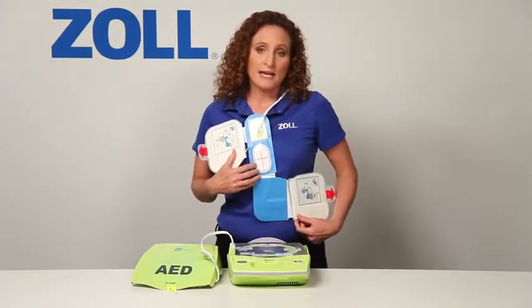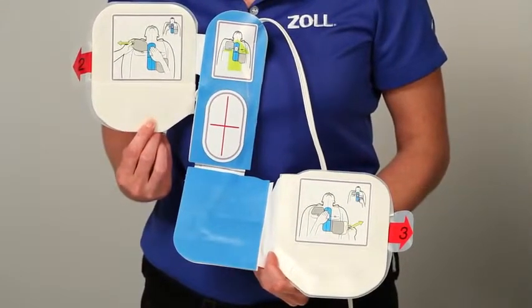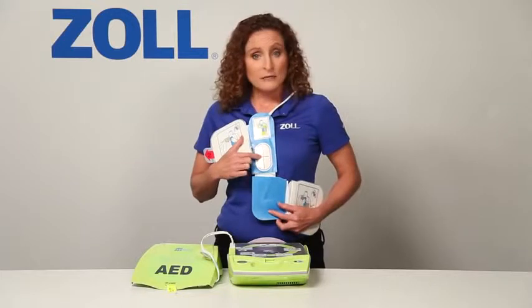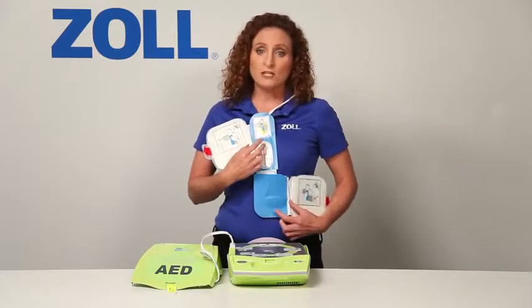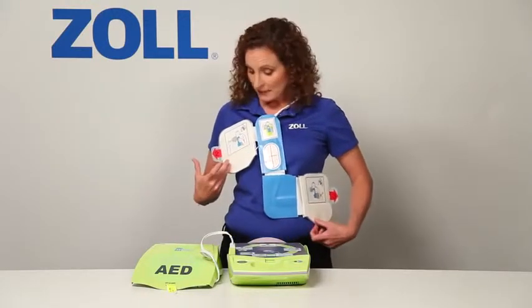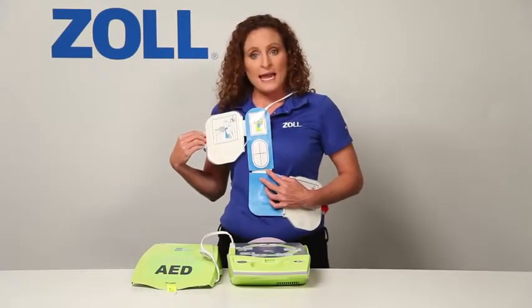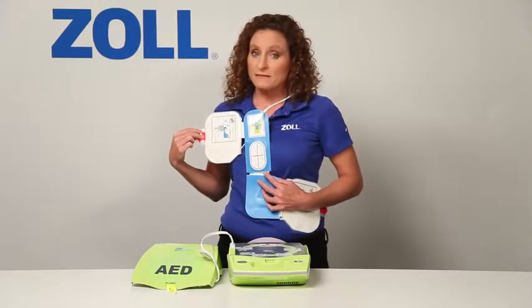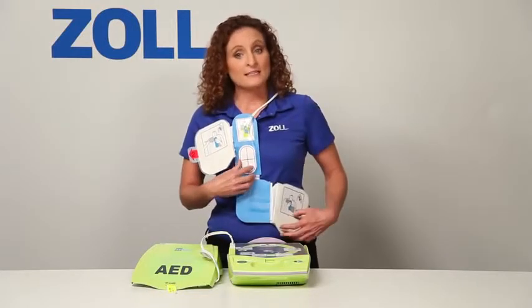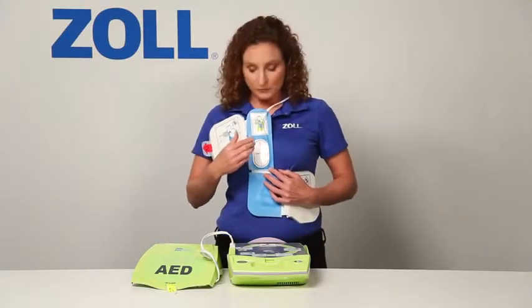These are CPR-D pads, which are quite different from the 2 electrode pads found on other AEDs. They are designed for fast, accurate electrode placement. The red crosshair is a placement landmark. Put it in the middle of the chest, directly between the victim's nipples, and the 2 electrode pads will fall into place naturally. Pull on this tab to uncover the gel on the pad and allow it to make solid contact with the victim's skin. Pull on this tab to attach the other electrode pad. Once the pads are attached, CPR can now be done by putting your hands on the red crosshair and doing chest compressions.